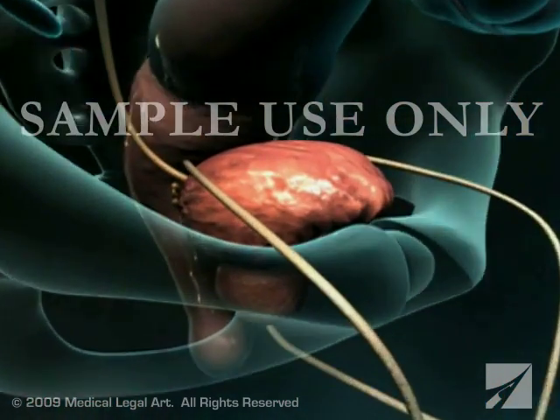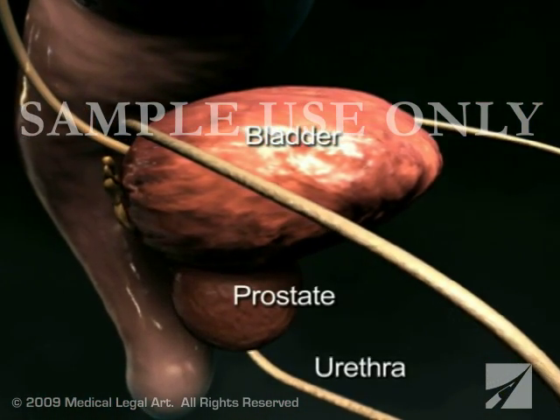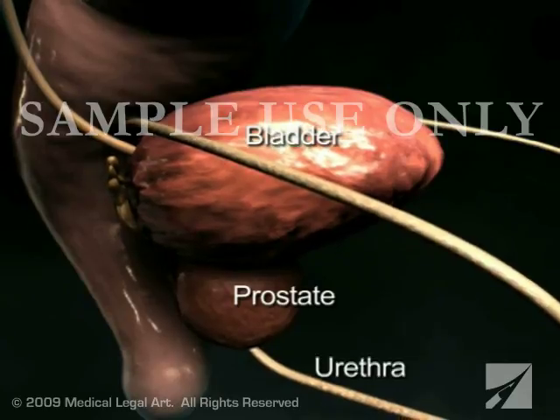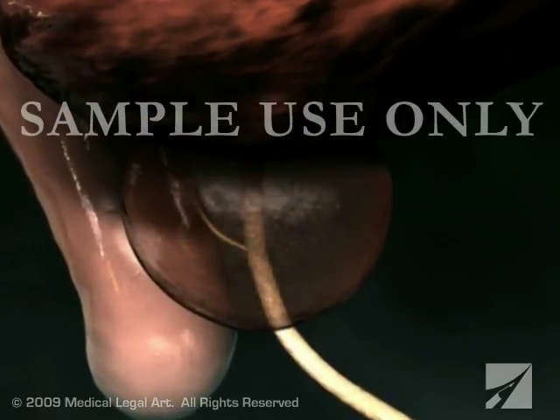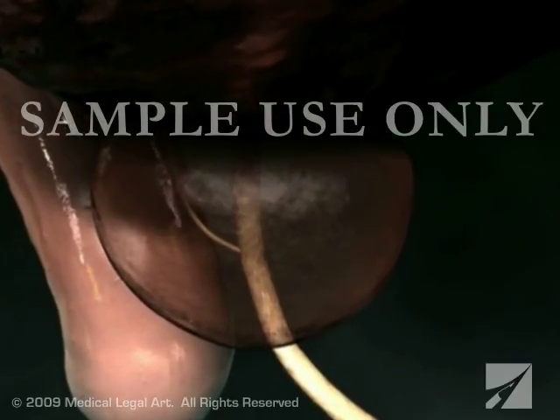Transurethral resection of the prostate, or TURP, is a surgical procedure during which part of the prostate gland is removed. The prostate is a walnut-sized gland in men that is located at the base of the bladder where it wraps around the urethra.